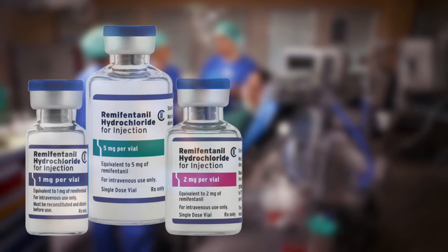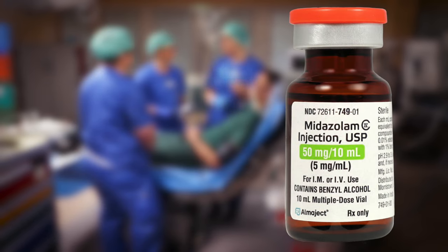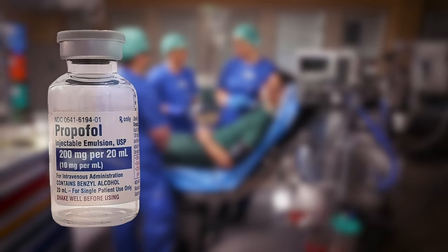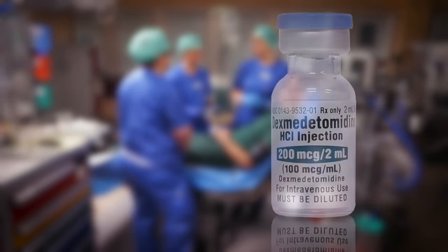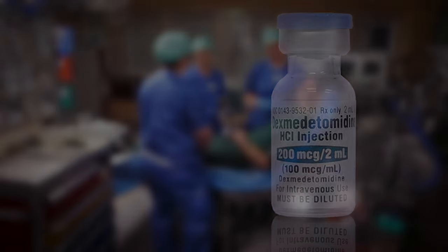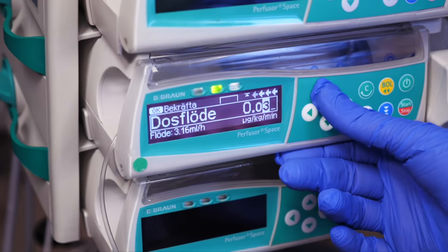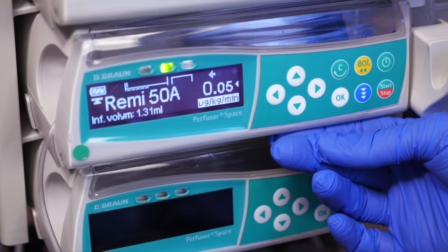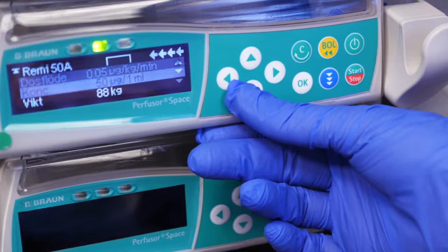Sedation is optional if you are very experienced with the drugs. It improves patient comfort and we believe it increases safety by suppressing cough and allowing for a calmer procedure, though some will argue that the risk of airway tonus loss is too great. A remifentanyl infusion is a good option due to its short-acting profile, titratability, and cough suppression, but if in doubt, request help or avoid sedation altogether.